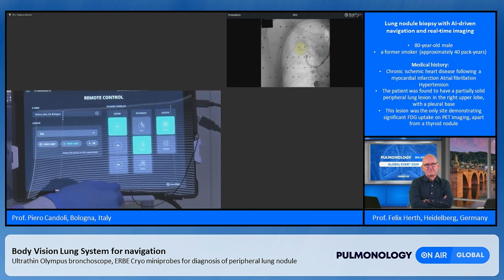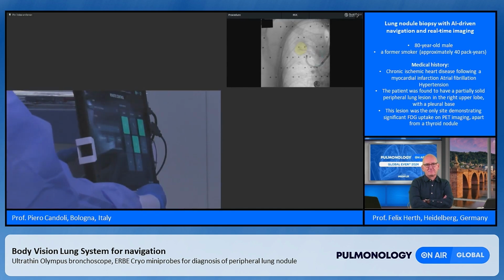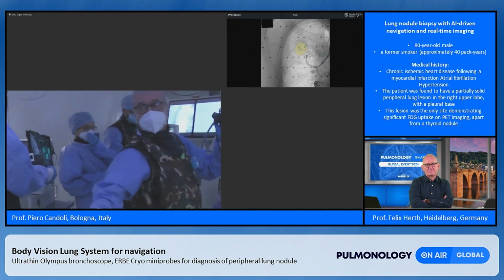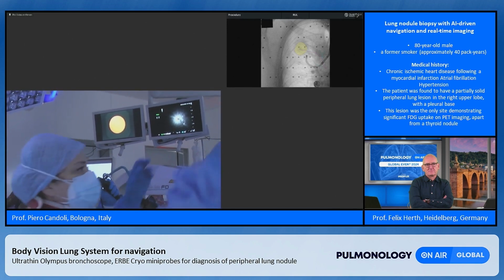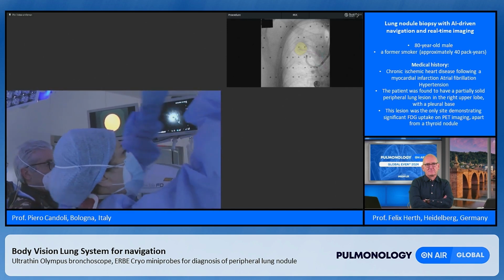Give me radial EBUS, please. Della sonda radiale. Dopo preparo la crio.